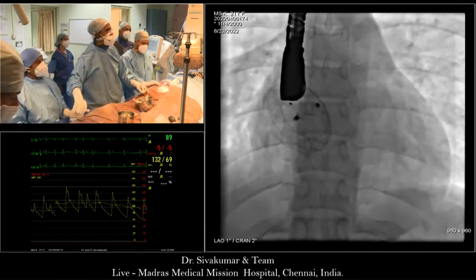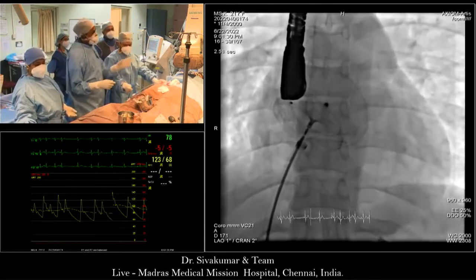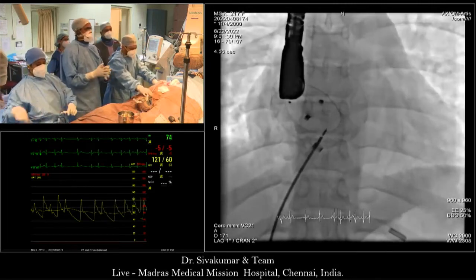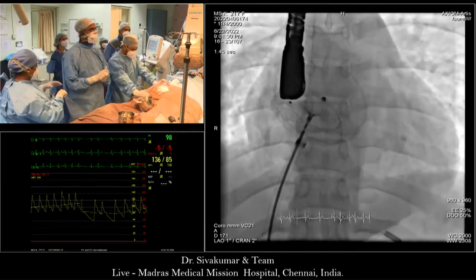You want to release it? We're going to release it. Srija, now show it. Really move. Show it. Shiva, final, very quick echo pictures.